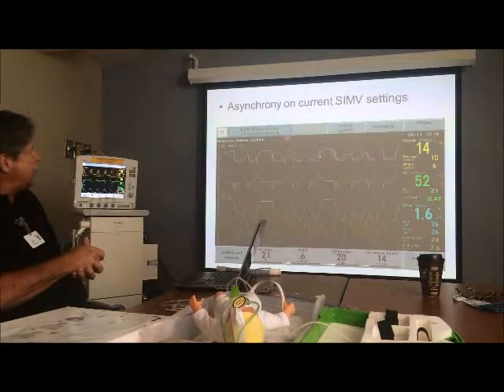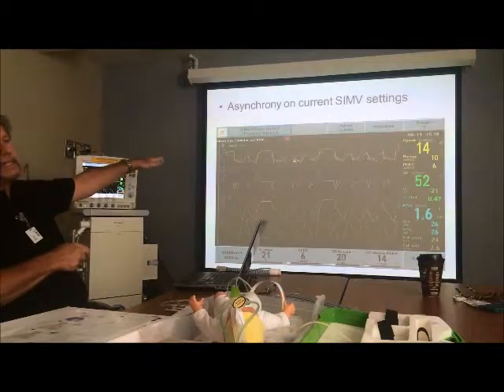But in some cases, we might have, here's another one where he's breathing twice within the delivery of the mandatory breath. So this is significant asynchrony.